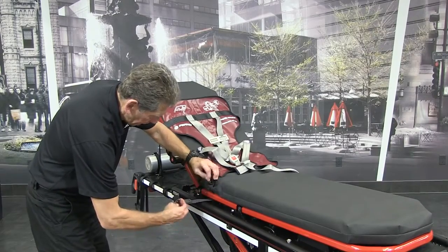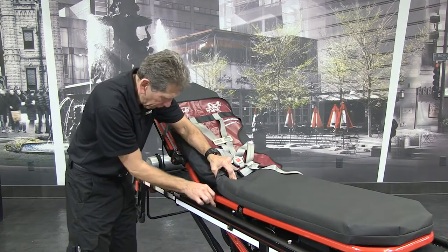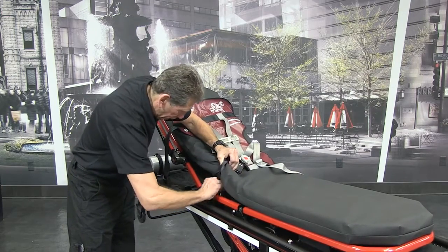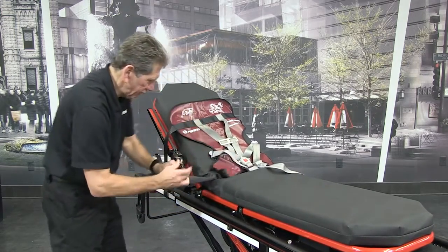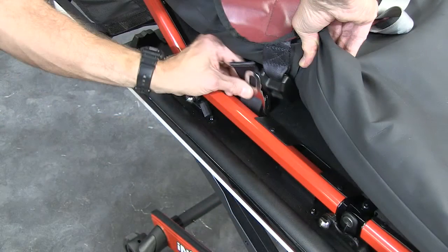To remove the PDMATE from the NX, detach it from the NX using the same strap buckle position when passing it through the slot of the patient surface of the NX — that is, with the tang male end upward and with the buckle housing facing the center of the NX.